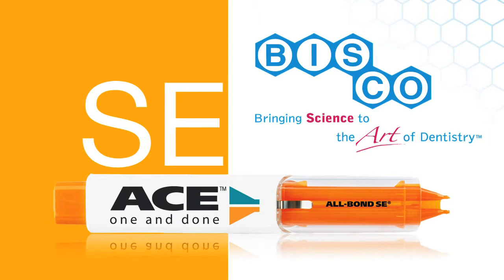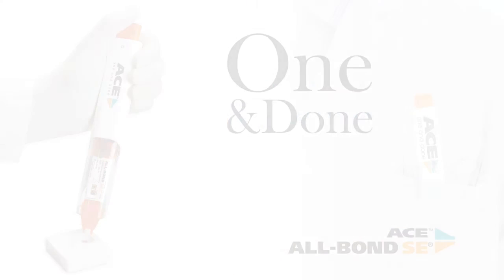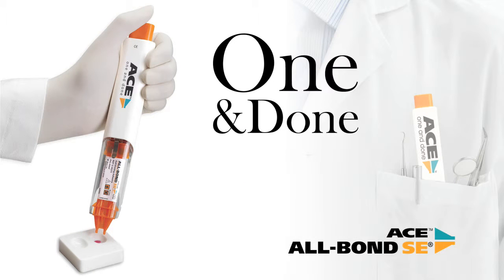Ace Allbond SE from Bisco is setting a new standard in bonding technology. Bisco's new self-etch bonding system is a revolutionary technology that brings together state-of-the-art adhesion and a new delivery innovation. Ace Allbond SE is a handheld all-in-one adhesive system that lets you etch, prime and bond in one simple application.